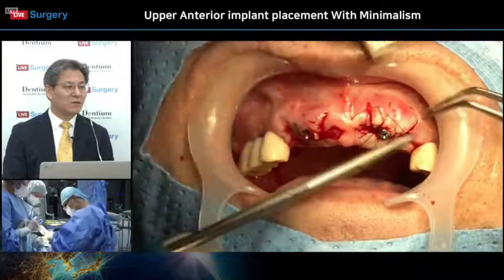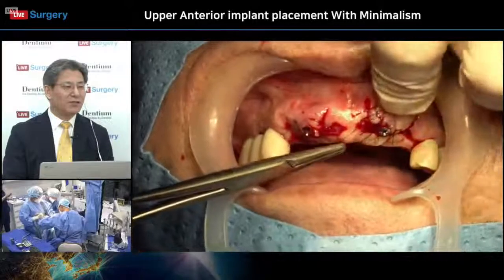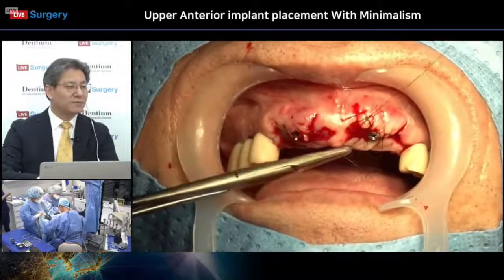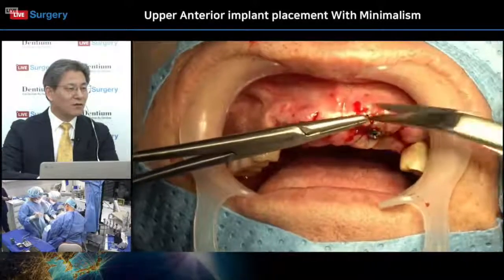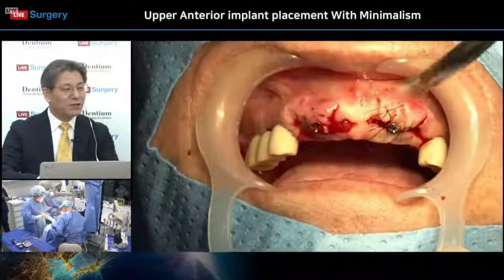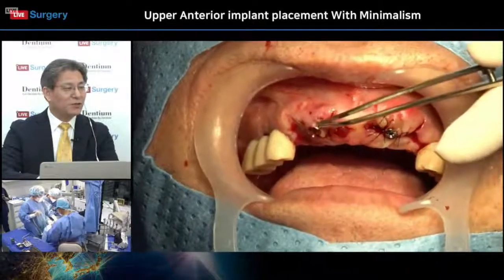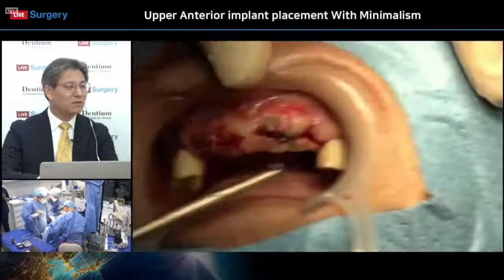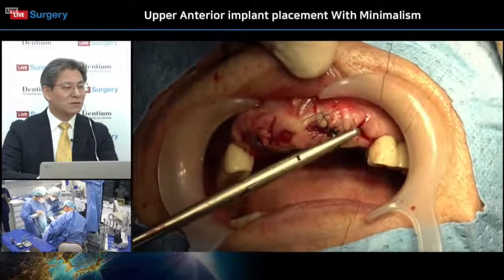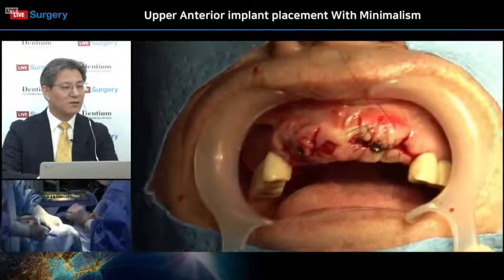It's also a modified suture technique. It adapts the flap closer and closer together. So even with a 5-0 suture, it is effective suturing with good flap adaptation. He wants to do one more suture at the distal part of the surgery site.